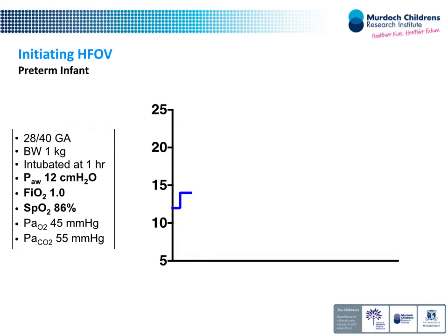Then it would be a good idea to make the X-ray to make sure that you see the white lung, that it is a recruitable lung, before starting to recruit this lung. So I would be cautious and let your own gut feeling tell you, oh no, this is really RDS and this is probably too low a pressure on conventional, and I need to proceed with high frequency to recruit the lung. But again, it's a diagnostic tool. It's not a volumetric assessment tool.